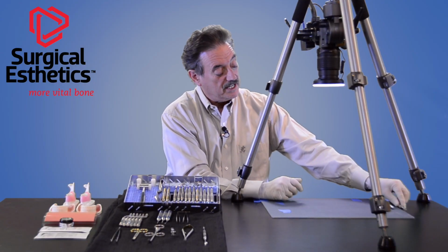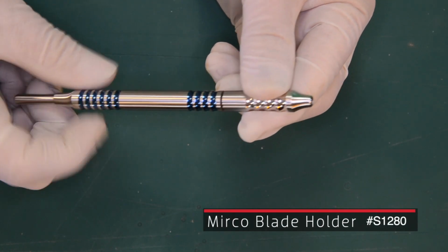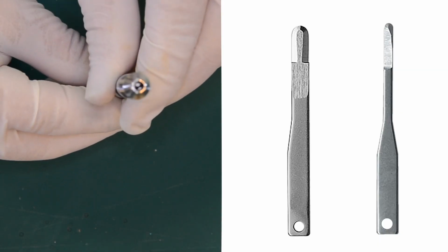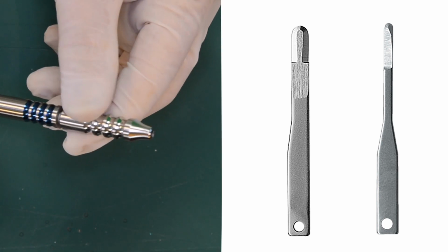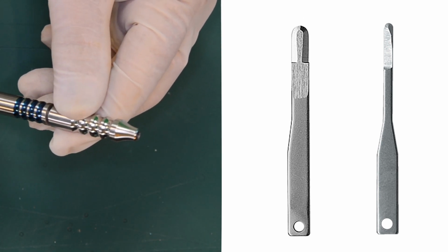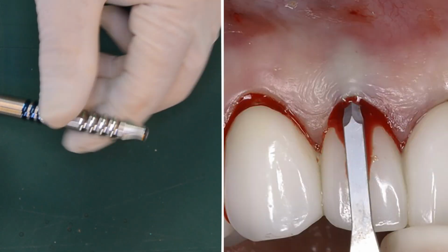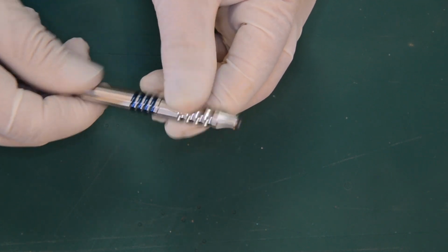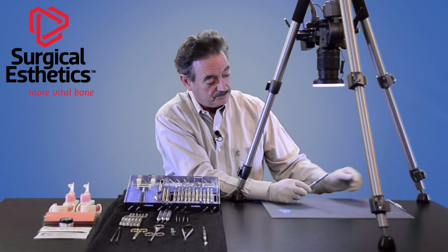The other one that's in the kit is a micro blade holder. And again, you insert the blade by unscrewing the handle part way, and then the blade goes in the end. And there are various numbers of micro blades that are available, from real small single end cutting sides to dual end sides. So micro blades, especially when you're dealing with thin, delicate tissue, are really beneficial.